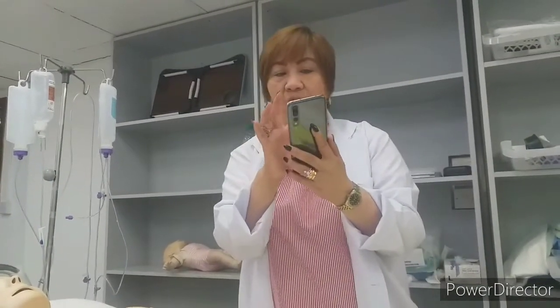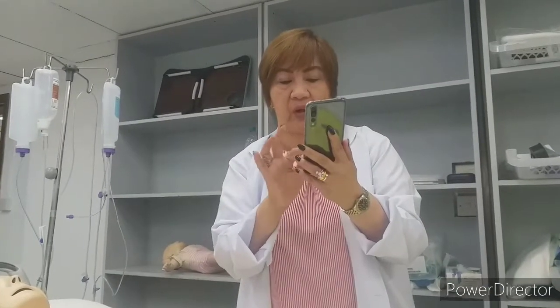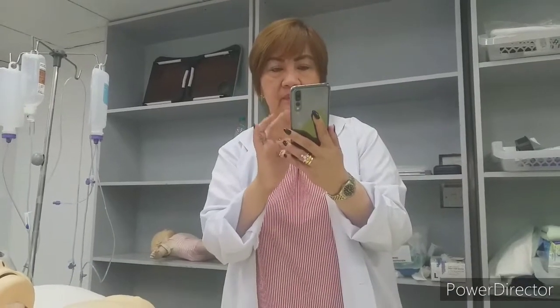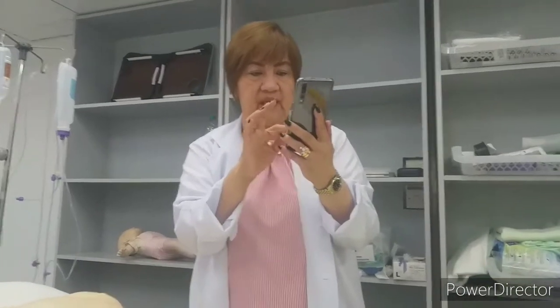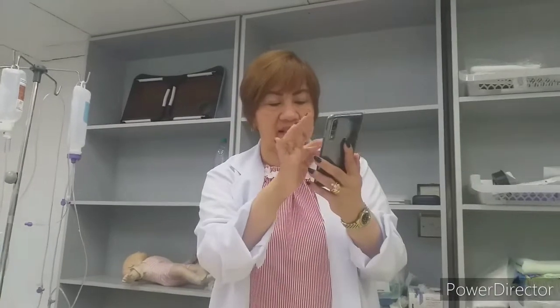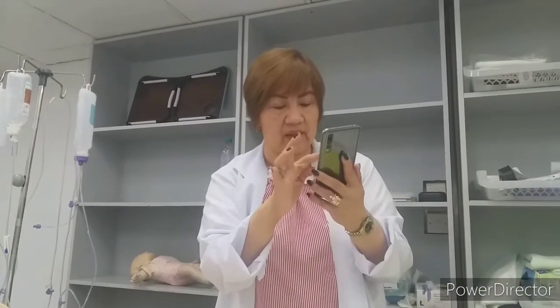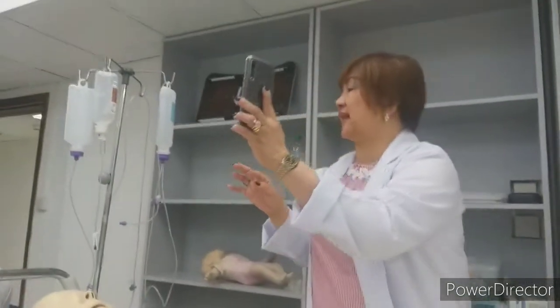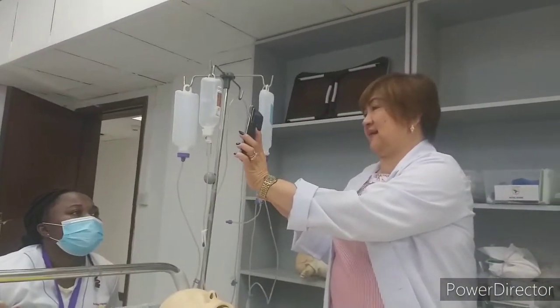Now, let's go with the colostomy, so that you will have your idea. If you can see this, it will be like that.